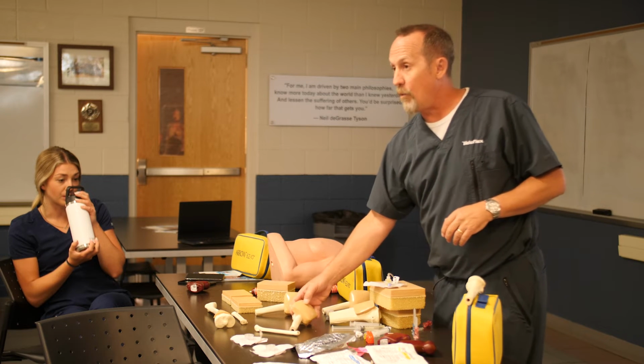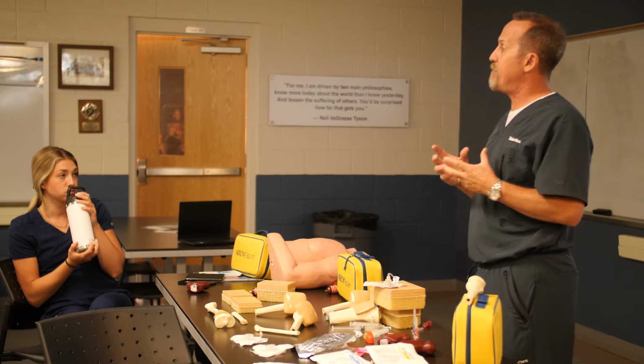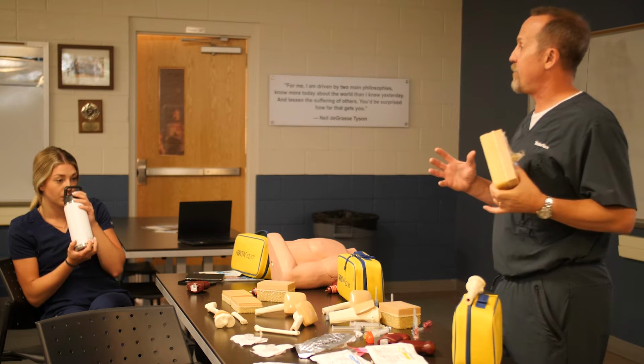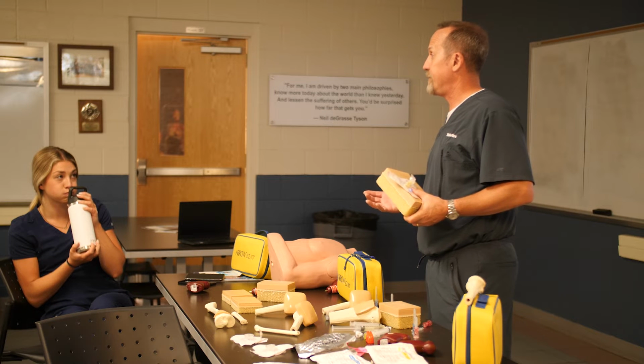Okay? But when we have an alert and conscious patient, and we do that rapid flush, the inside of that bone, this cancellous bone has a ton of nerve endings in it, and it senses that change in pressure, and it can be pretty significant. Like, you have an alert, conscious patient, and you flush them, they'll jump off the table. They're gonna feel it, okay?